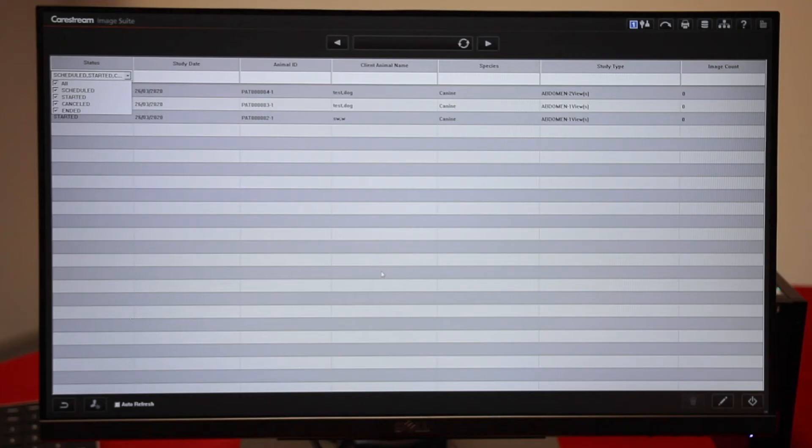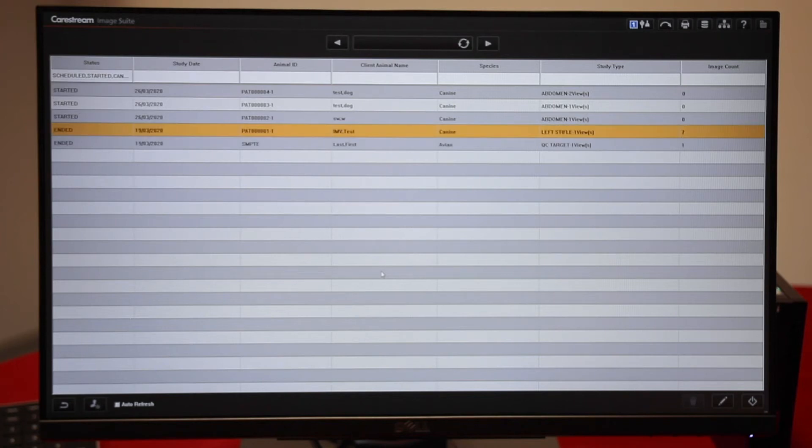Then click anywhere on the screen. This will bring up all the patients you've ever had in.